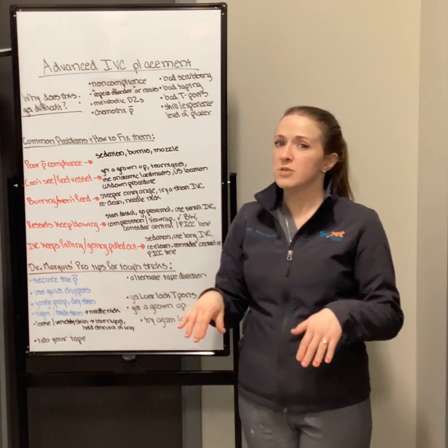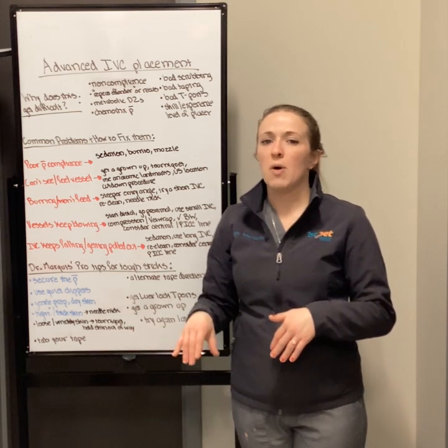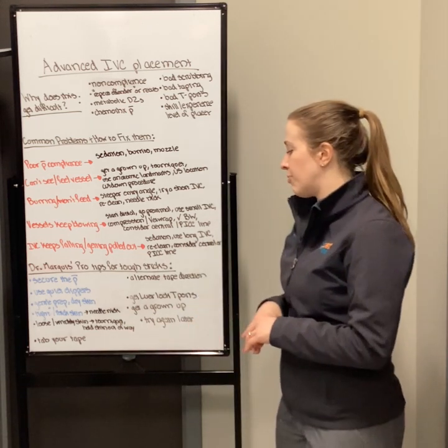So if you had a tough stick, maybe you want to keep it in there, try to preserve that catheter as much as possible. So that's why I think that can be helpful.